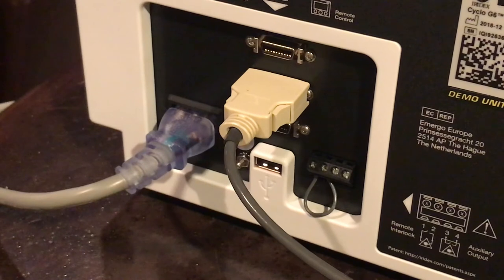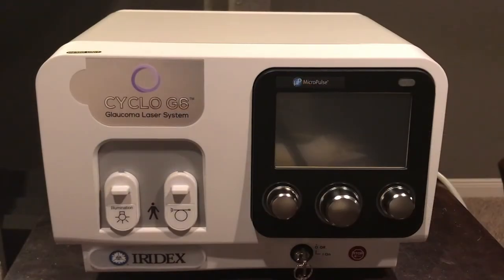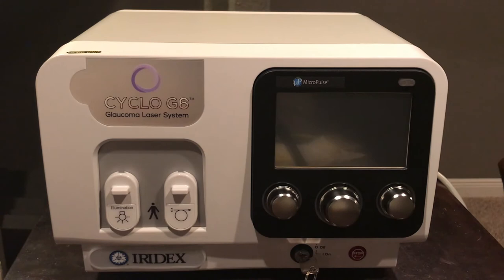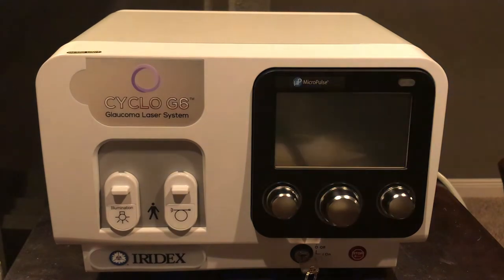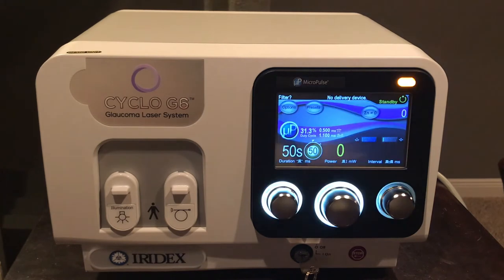You may choose any one of the three multi-function port inputs. Once you have plugged the power cord into the unit and into the wall receptacle, and ensured that the foot plate is plugged into one of the multi-use ports on the back of the laser, turn the Cyclo G6 on by rotating the key to the right. This initiates the self-check and startup process, which may take 30 to 45 seconds, ensuring the laser is operating at optimal form. Once complete, you will see the startup screen.